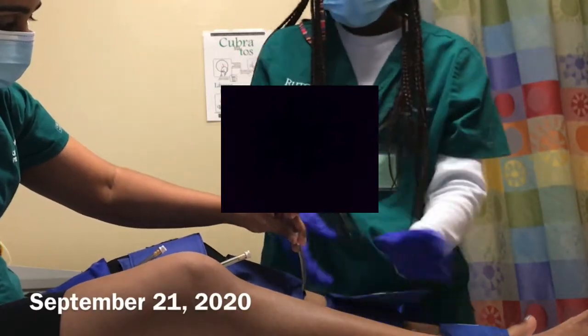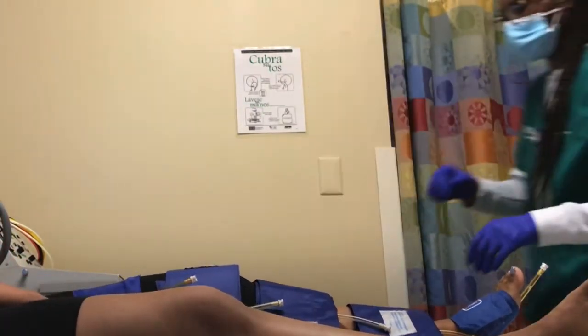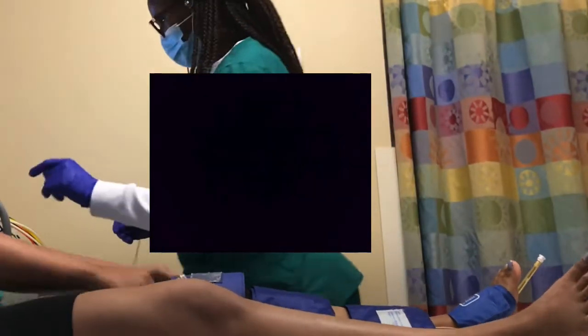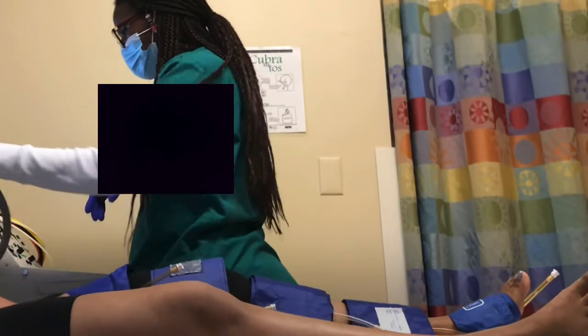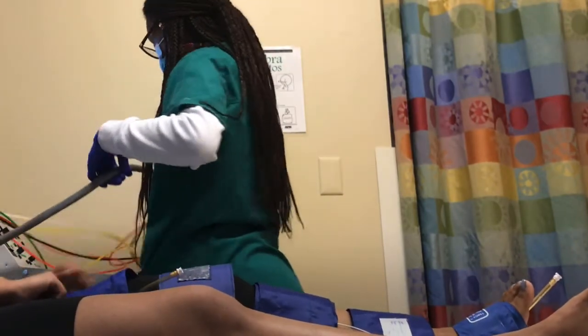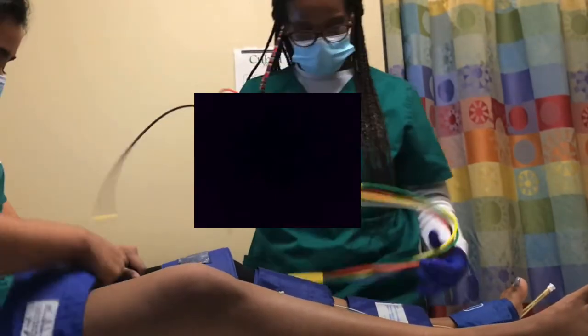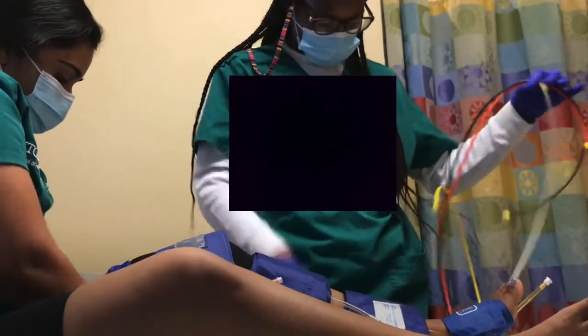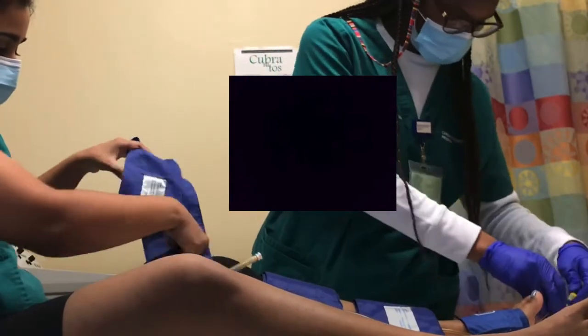What's up you guys? Brianna here. So in this video I'll be practicing a PVR on my classmate. The fact that I have a classmate in this rotation is really beneficial and it's awesome because I get to practice. We get to practice on each other and whenever we have off time or one of the techs is out for lunch we take that opportunity to practice different exams on each other.